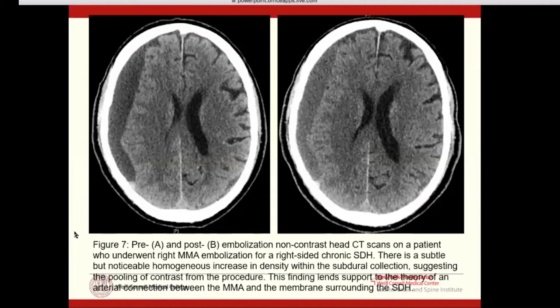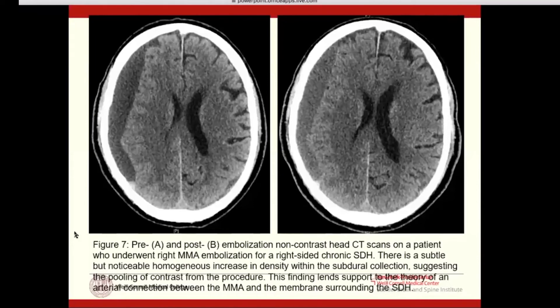On the left is a pre- and on the right is a post-op head CT of a patient before and after embolization. When we first did these procedures, we were getting calls from the radiologist saying the patient was having interval acute hemorrhage, because the blood was slightly more radio-dense on the right than on the left. But it's not interval hemorrhage — it's contrast pooling within the subdural hematoma in that space. All of these radiographic findings were part of our proof of concept before we had clinical data.